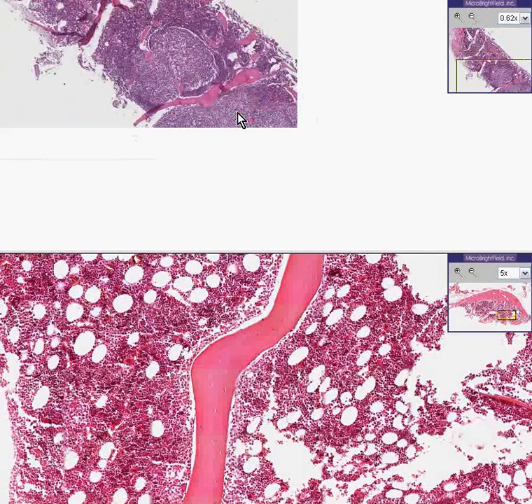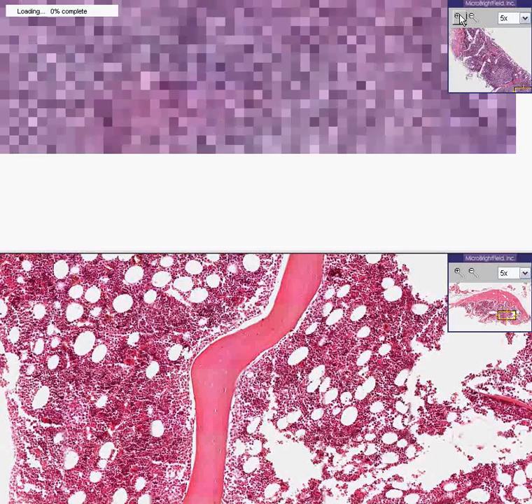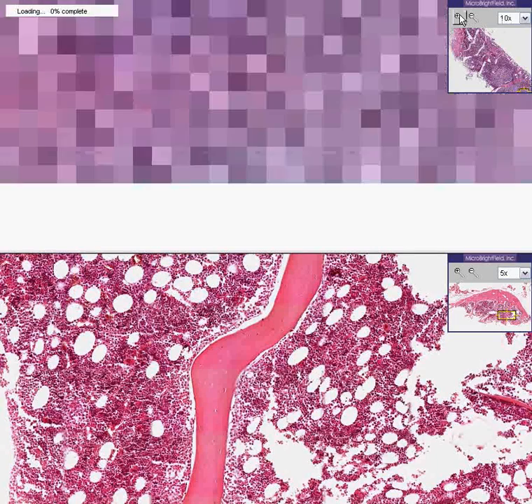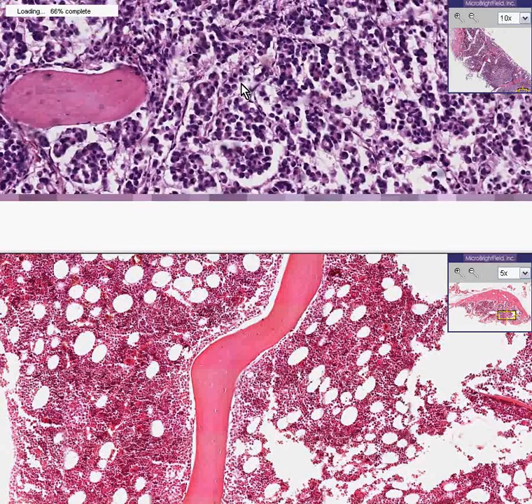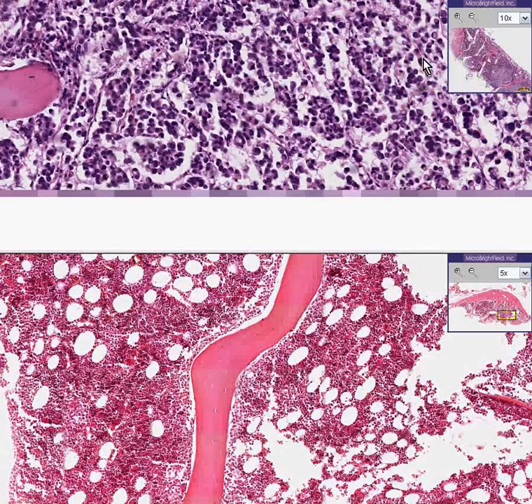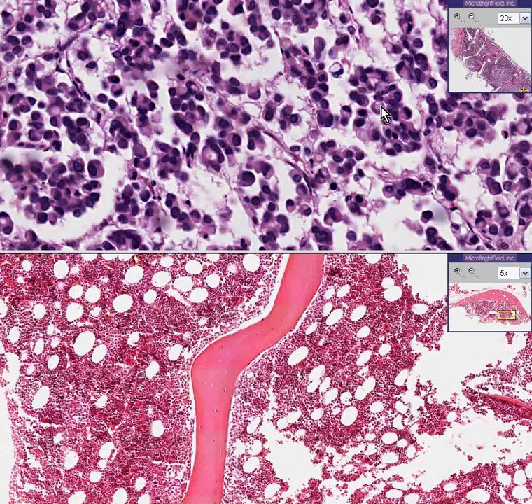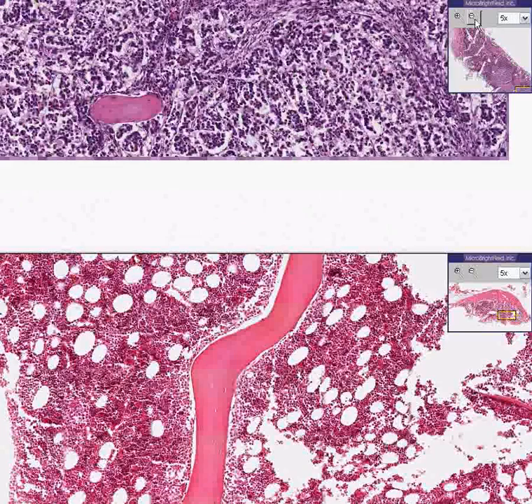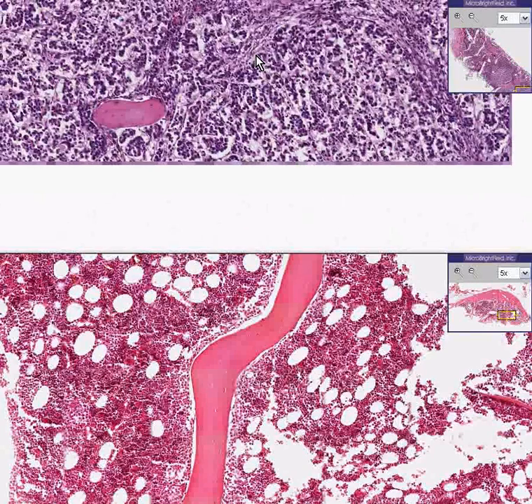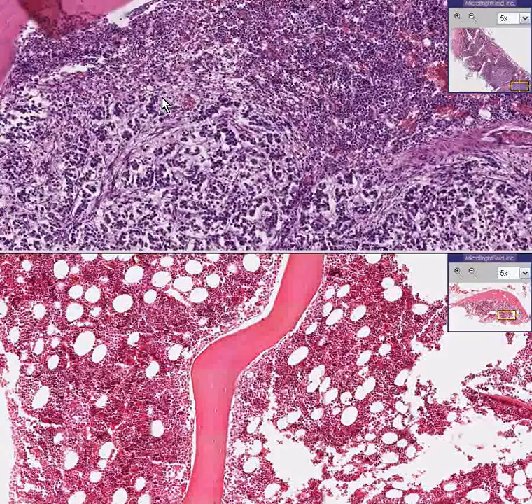Sure enough, when you zoom in on it, you can see that they do not look like hematopoietic cells. They look like epithelial cells that have a lot of little vacuoles in them, like poorly differentiated adenocarcinoma does. These are signet ring cells. And that's one quick way to spot metastatic carcinoma within a bone marrow.